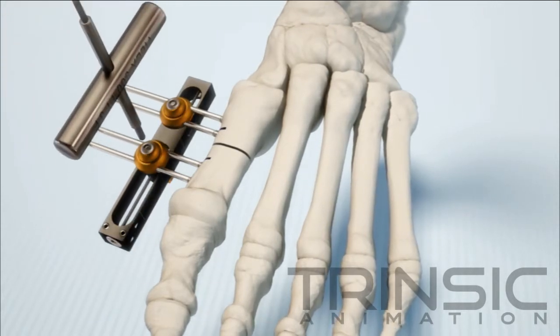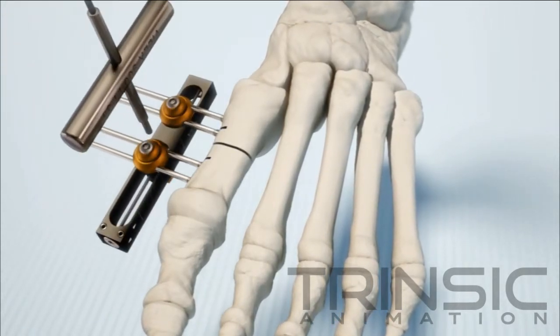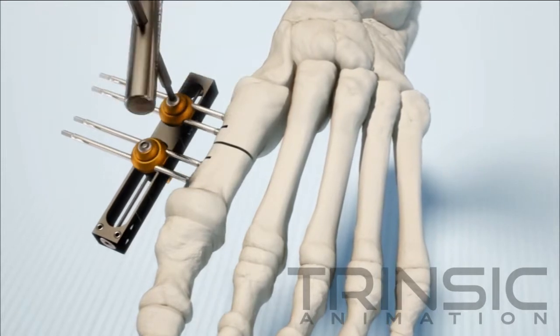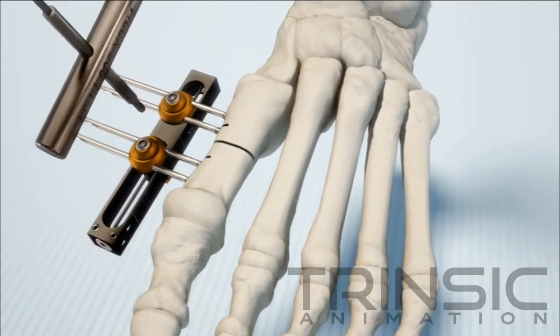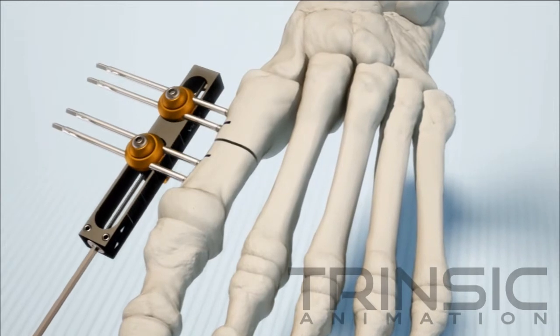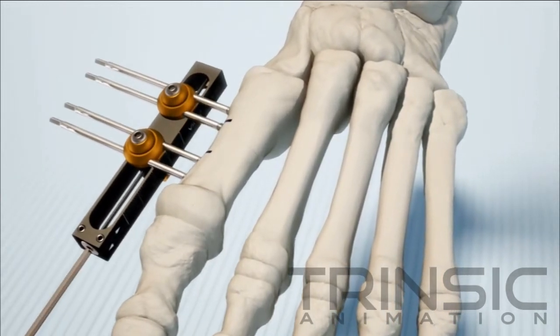With the orientation established, hold the position while an assistant locks the half pin's carriages. Use an Allen wrench, distract and re-close the osteotomy and watch how the bone surfaces compress toward each other.